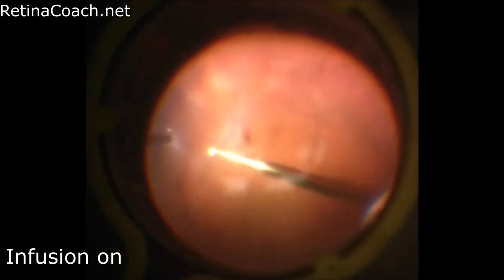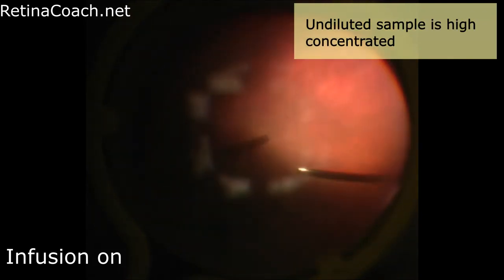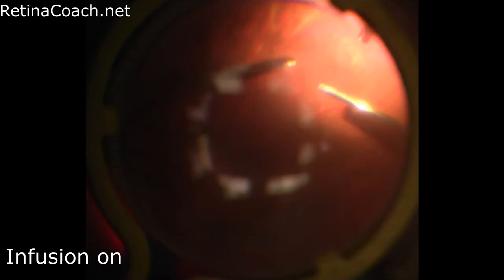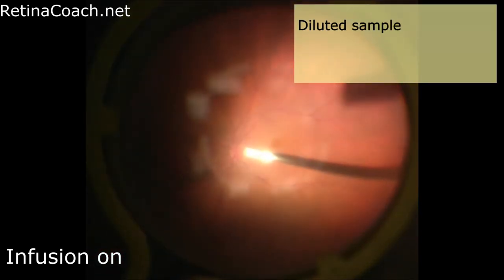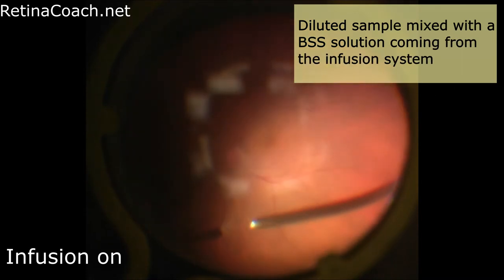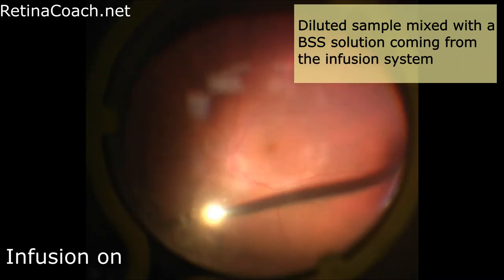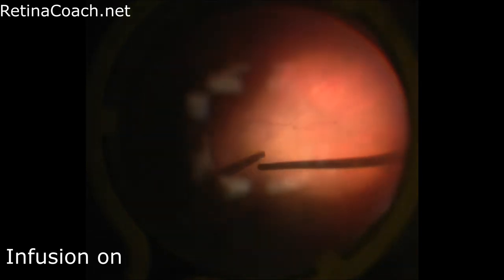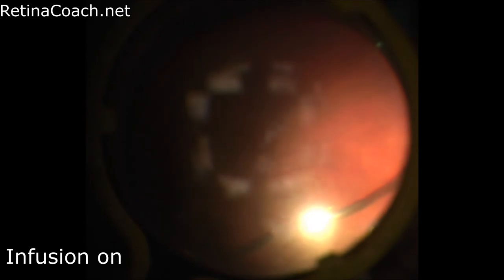The undiluted sample is highly concentrated, which enhances diagnostic yield and is especially important in cases of suspected intraocular lymphoma. The diluted sample is mixed with BSS solution coming from the infusion system. To perform a high-quality diluted sample, it is important to remove the vitreous during vitrectomy and not just aspirate BSS solution. Usually around 10 ml of diluted sample are aspirated.